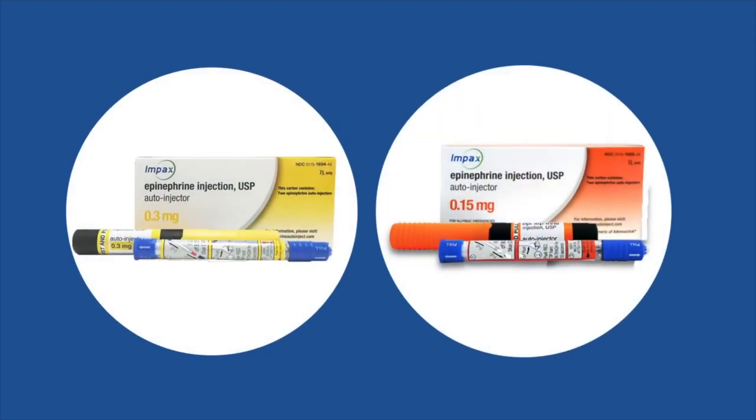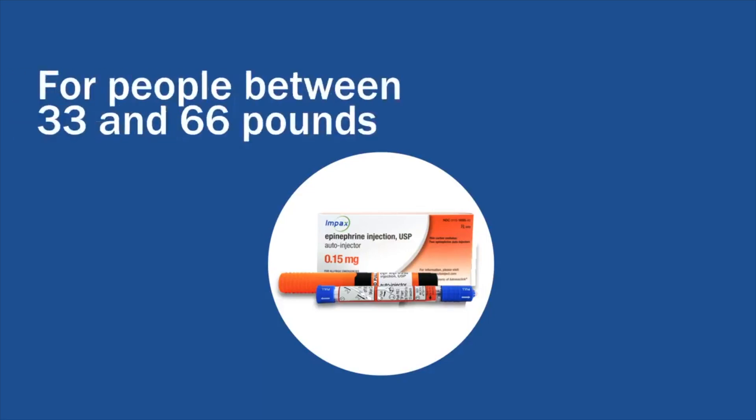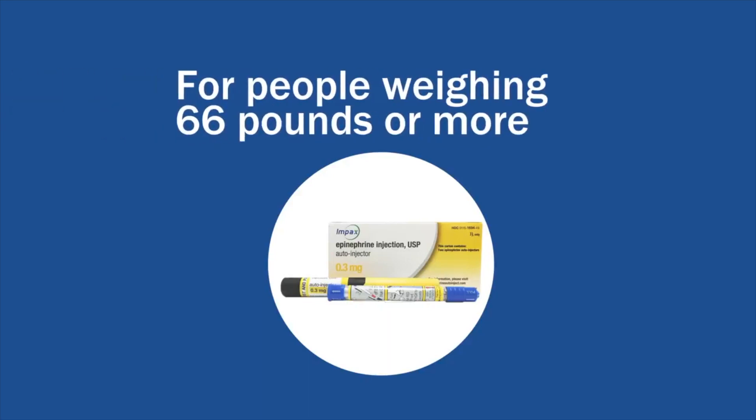Impax makes two epinephrine auto-injectors. Epinephrine Injection USP Auto-Injector 0.15 mg with the orange label is for people who weigh 33 to 66 pounds. Epinephrine Injection USP Auto-Injector 0.3 mg with the yellow label is for people who weigh more than 66 pounds.